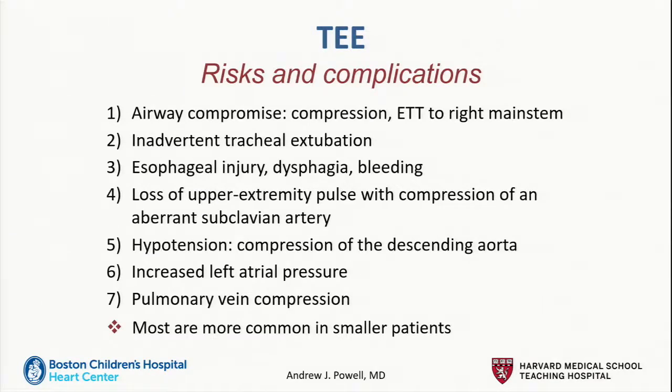Risks and complications of TEE, airway compromise. So this can be compression, and this never happened to me, but there is the potential that as you're moving the TEE probe in and out, you might also move the endotracheal tube in and then push it down and result in right mainstem intubation there.